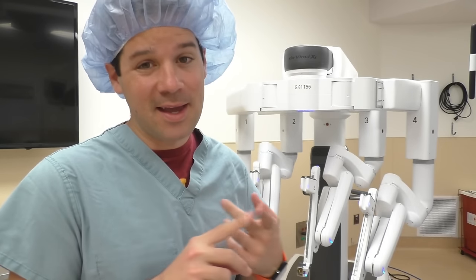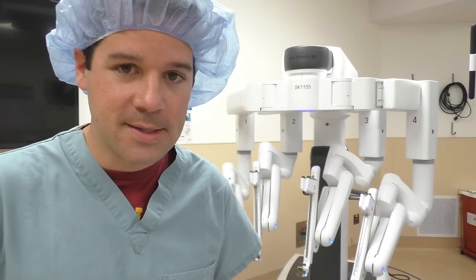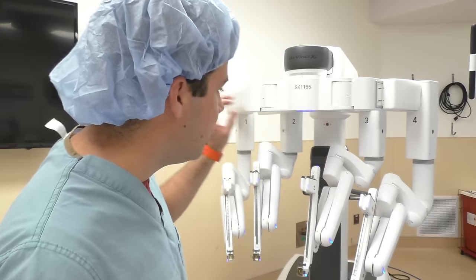We have XIs and SIs here at my hospital. I specifically just wanted to go over the XI though, because that is the newest technology, and if your hospital doesn't really have a robot yet, they'll most likely be buying this one if they're buying their first robot.